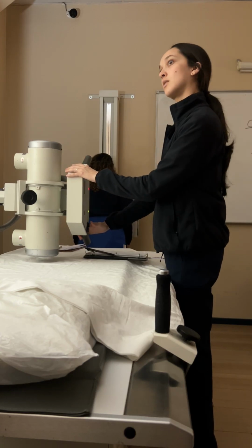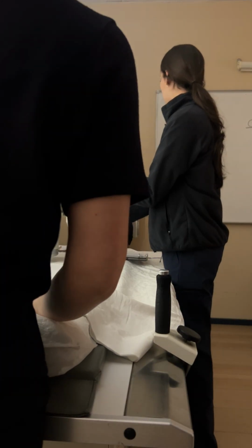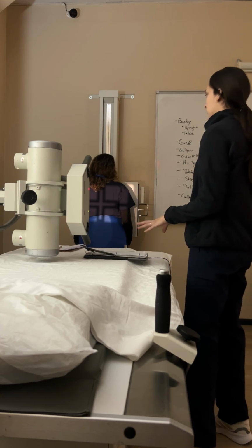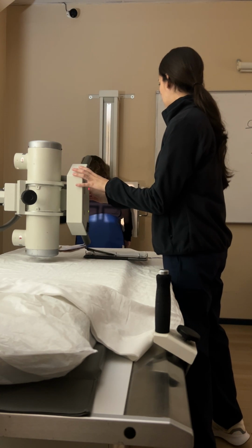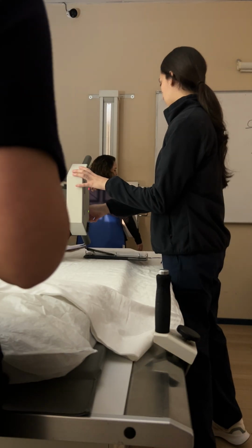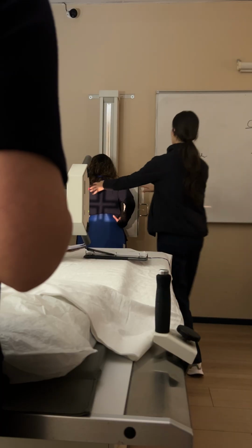But the X-rays are very repetitious. Can you turn the light on? Yeah, that's good. I would fix the collimation inward, because you don't want to bring her arms in. Have her go against the wall all the way. Put your hands on your hips and then roll your shoulders forward to the floor.